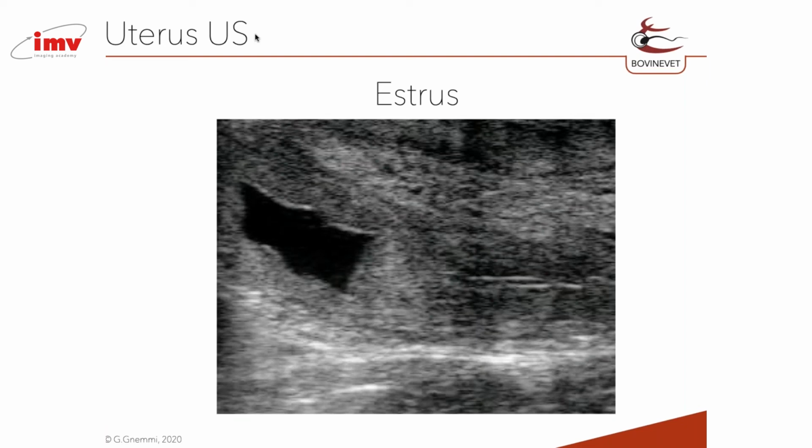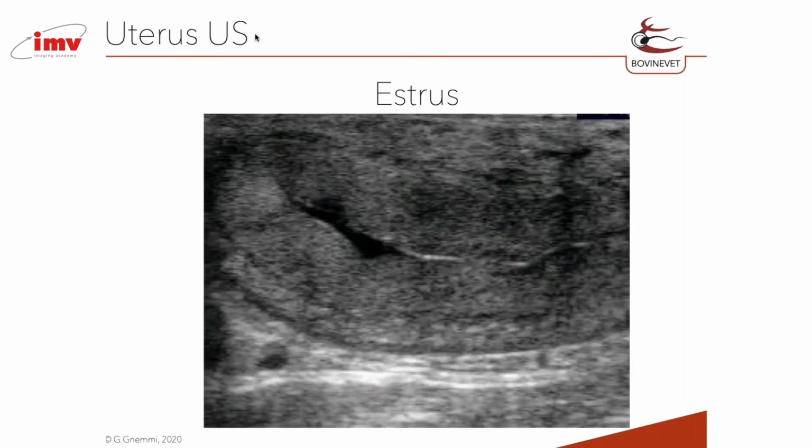So you see that it's very easy to distinguish the uterus in function of a steroid hormonal profile that may be estrogenic during the follicular phase or progestinic during the luteal phase. In another section, in this case a longitudinal section, you see that very close to the estrus moment, the difference in thickness between the contracted myometrium and the thicker endometrium is very high.